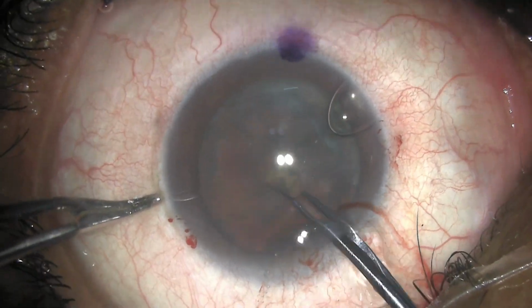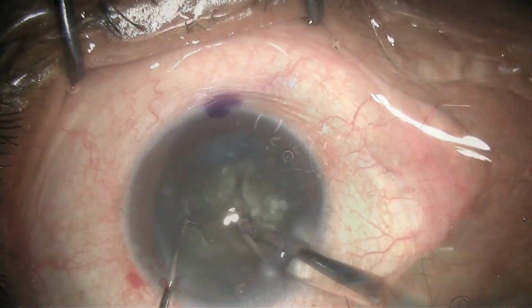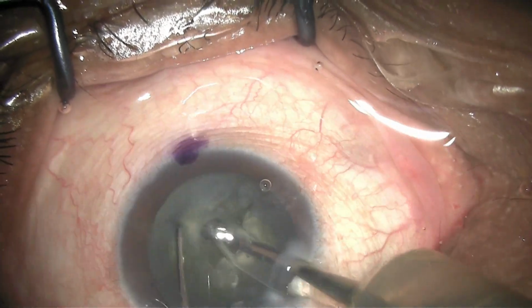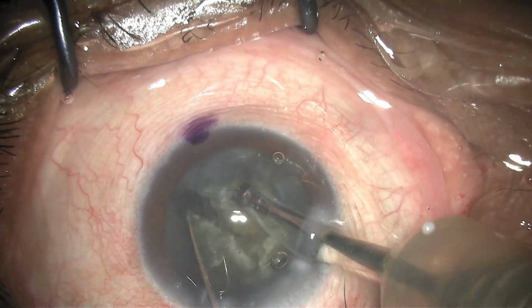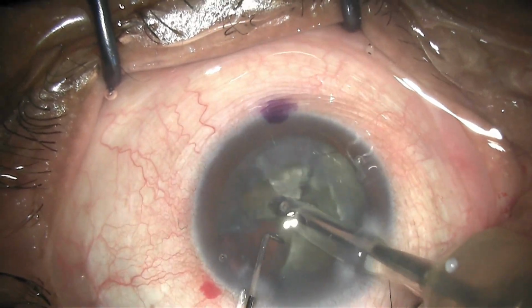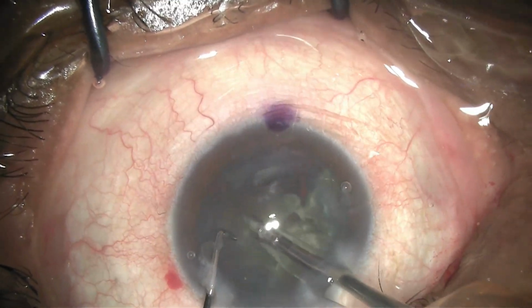Here I am using a Haldipurkar Rexis forceps to make a Rexis of around 5.5 millimeters. And this is a hard cataract, so I am using the direct vertical chop for phaco. And this is a sped up view of the phaco going on. And this is my preferred method for doing phacoemulsification in hard cataracts, where I use the vertical chopper to chop the nucleus into 4 or 5 quadrants and then emulsify each of them separately at the iris plane.